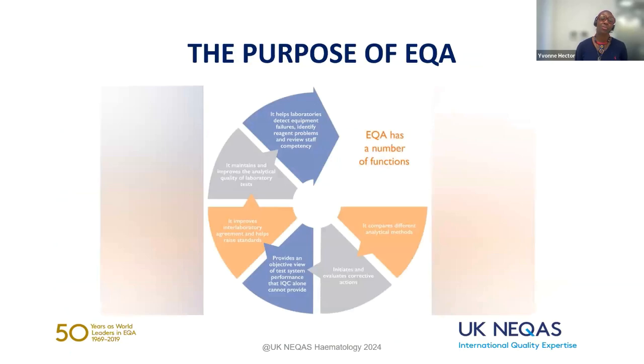So EQA plays a vital role in maintaining the high standards required for accurate and reliable lab testing. It is essential for effective patient care and for you to know that you're working to the standard that you believe that you're working to. It's also a crucial component in the lab and clinical testing, and it aims to ensure the accuracy, reliability, and consistency of test results across different labs.